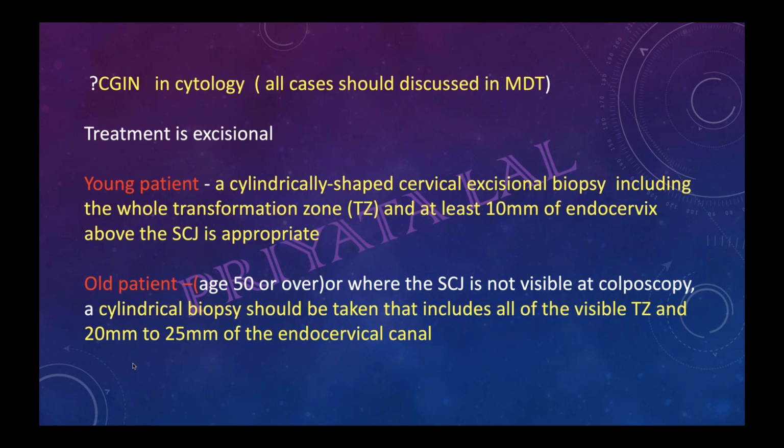And I just want to share something, but it is not related to MRCOG. Sometimes, if a postmenopausal patient comes with some problem, and we have to do colposcopy and look at the transformation zone, you will not be able to find anything. Sometimes even estrogen is given as a treatment to them, so that the transformation zone or squamocolumnar junction, because of these hormones, will come out, and then the colposcopy is done.